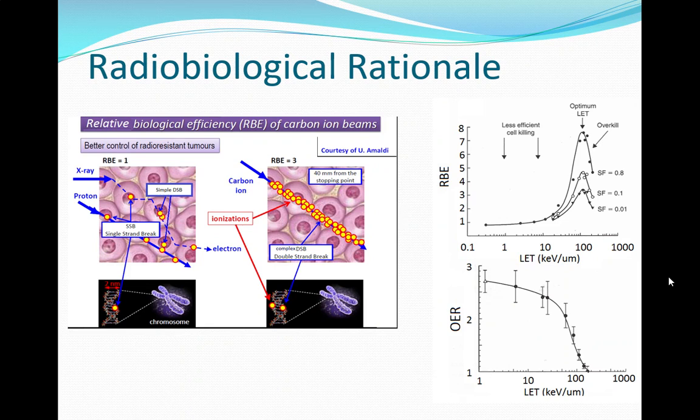It's more like you get a break maybe per photon. So it's very sparse. Like I said, for protons, you absolutely get breaks per proton. With carbon, you get a lot of breaks. So that's kind of what they're doing. It's a little bit exaggerated. This isn't reality.